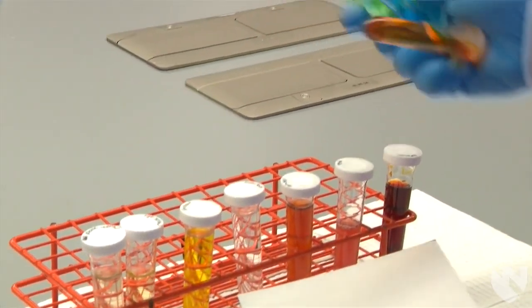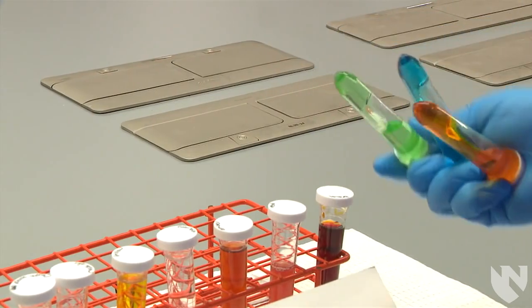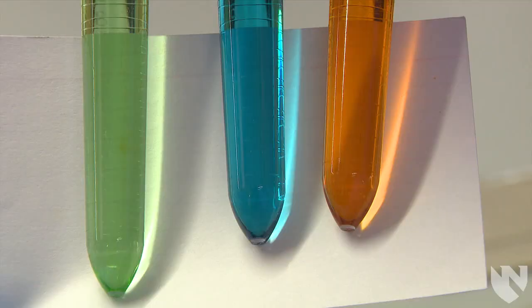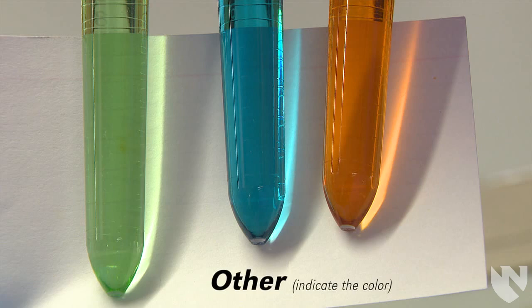Sometimes you may see urines with shades of green, blue, or orange. If the color you see is not on your report form, then you can report the urine as other and indicate the color.